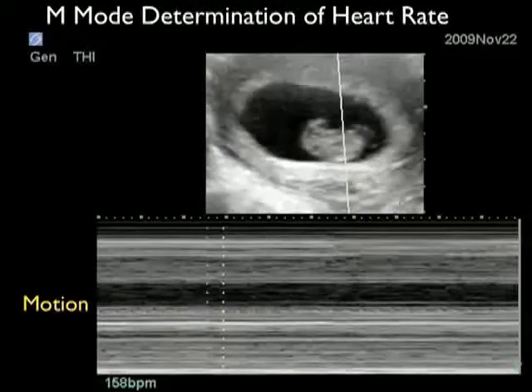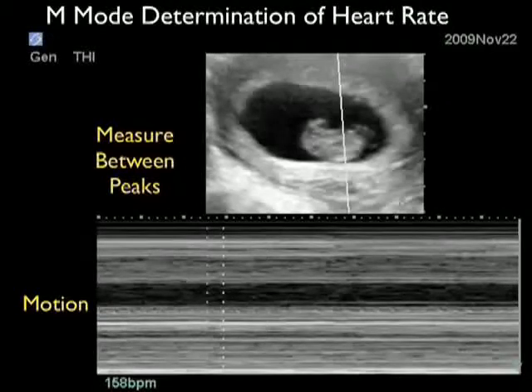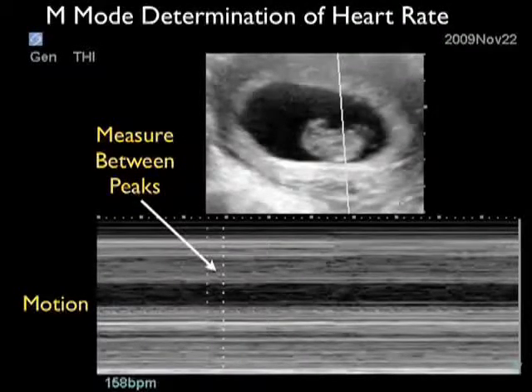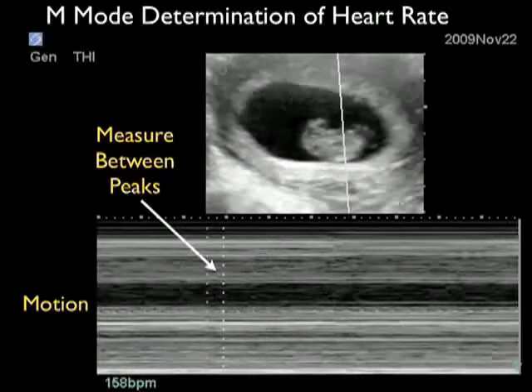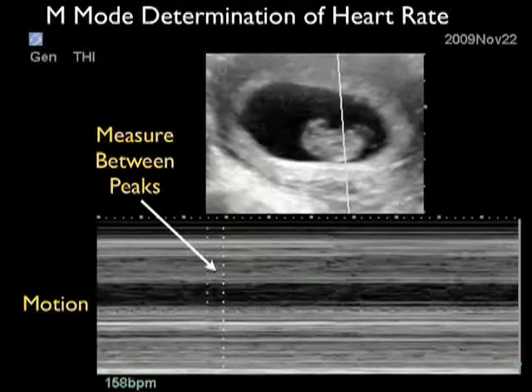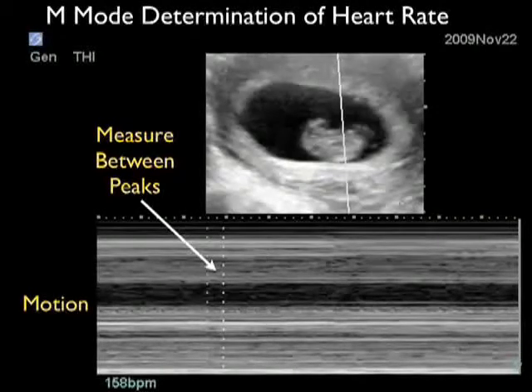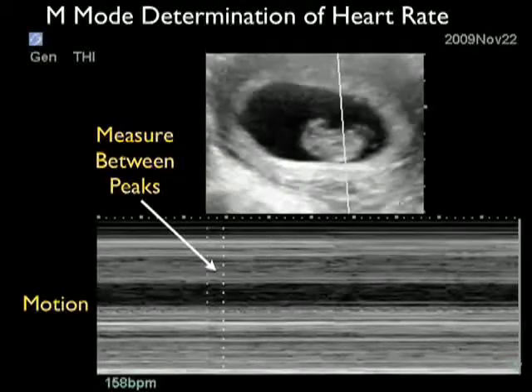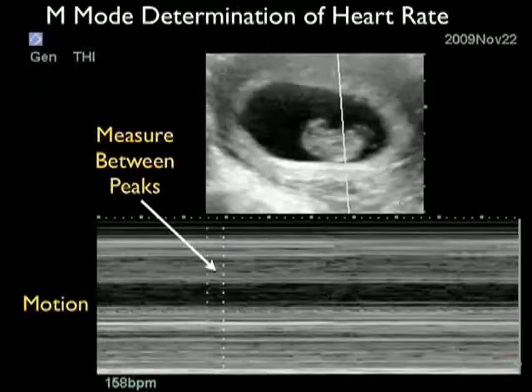Here we're going to use M-mode to determine the fetal heart rate. Notice we have the fetus zoomed up towards the top of the image, and we're placing the M-mode caliper directly over the fetal heart. Towards the bottom, we see the M-mode motion strip with little waves showing the motion of the fetal heart. In this particular ultrasound machine, we measure between each peak, and we can see a heart rate determination of 158 beats per minute. This is something we can print out and place on the chart to show that at the time we saw the baby, there was an actual heartbeat.